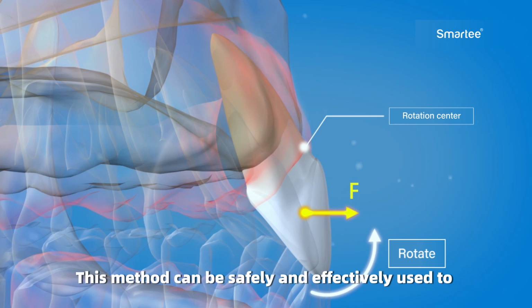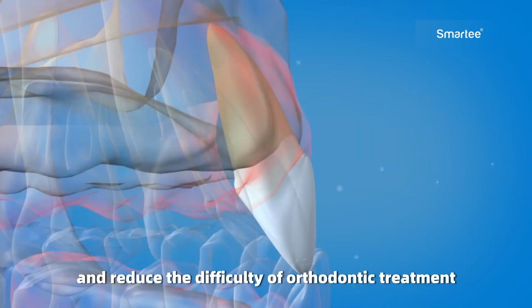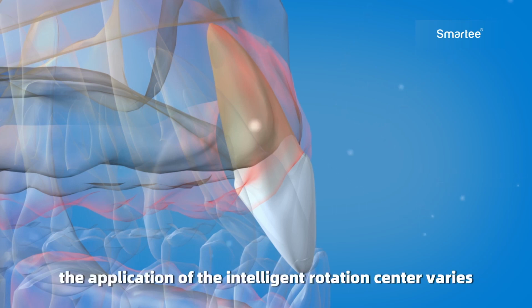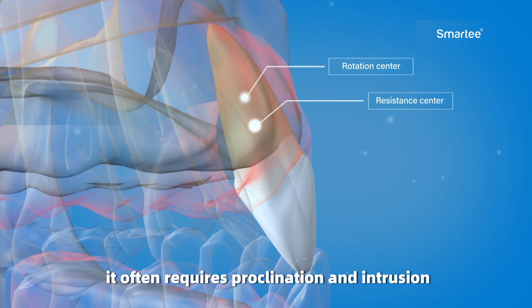This method can be safely and effectively used to apply torque control and anterior tooth intrusion, and reduce the difficulty of orthodontic treatment for some deep overbite cases. In different cases, the application of the intelligent rotation center varies. For anterior crossbite correction using clear aligners, it often requires proclination and intrusion.